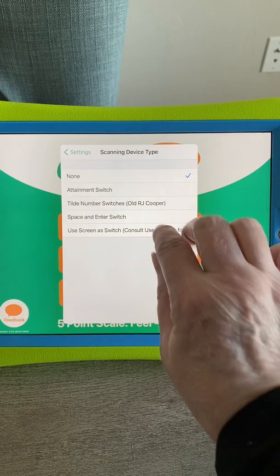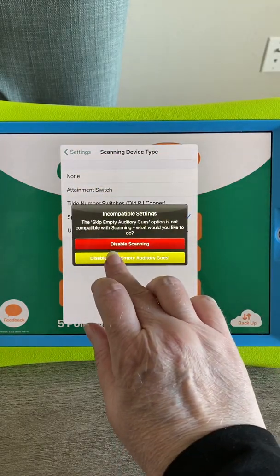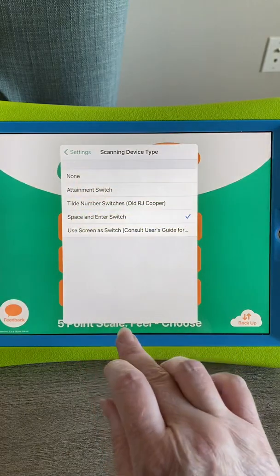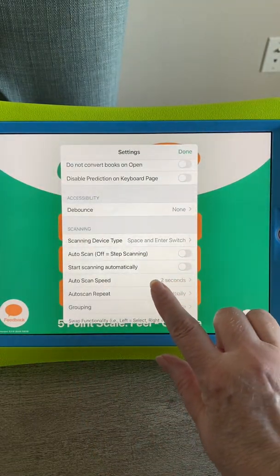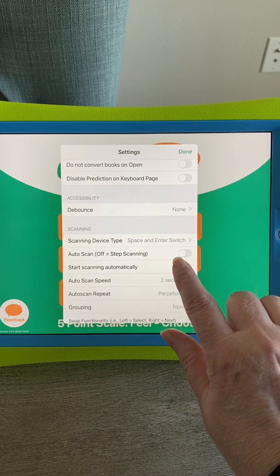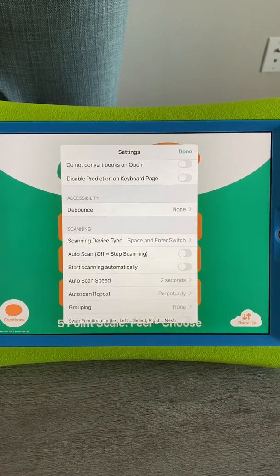It has to be the space and enter switch for the Bluetooth to work, so I need to make sure there's nothing conflicting there. Then I can decide if I want to use step scanning, which I'm going to do since I have two switches built into the Bluetooth.